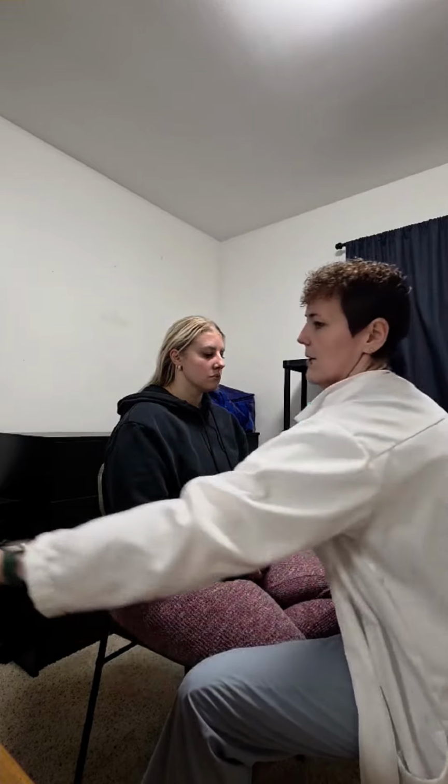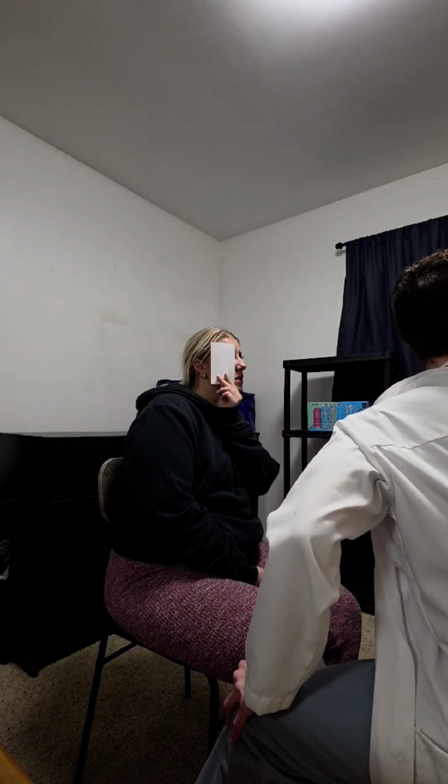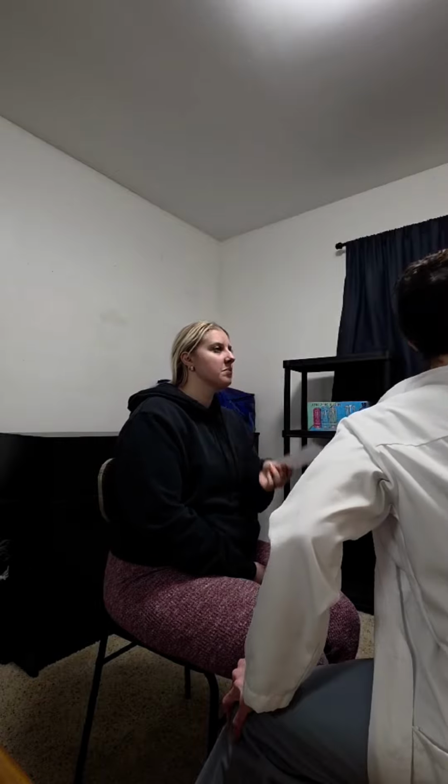We're going to do some eye exams, okay? I'm going to give you a note card and you're going to put this over your left eye. I have a chart right behind me. Go ahead and read with your right eye to the furthest level down that you can. E F P T O Z L P E D P E C F D E D F C Z P. Okay, go ahead and do it with your other eye. E F P T O Z L P E D P E C F D E D F C Z P. Perfect. Both sides are 20/20 vision.